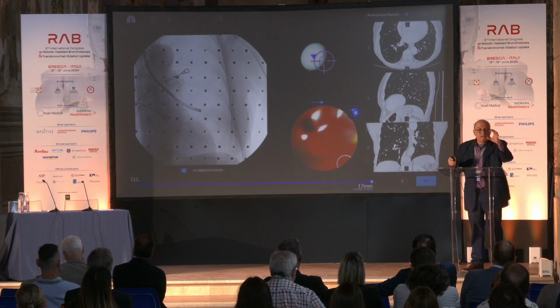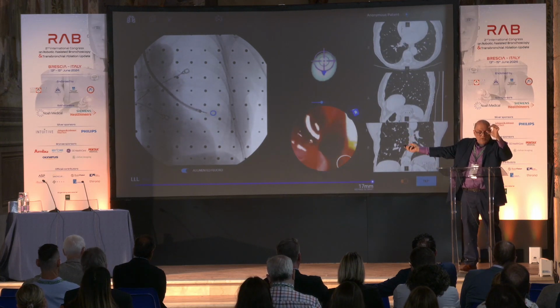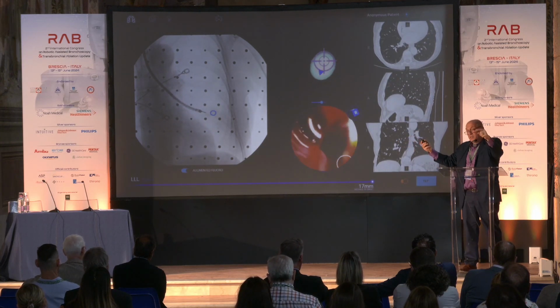If you put the tool out and it's lying within that blue ball, and I spin, say, 15 or 20 degrees in a different angle, and it's still within the blue ball, I probably have 99–100% of the time a tool-in-lesion. I don't even need to do a tool-in-lesion spin.